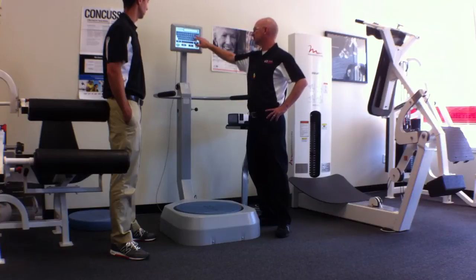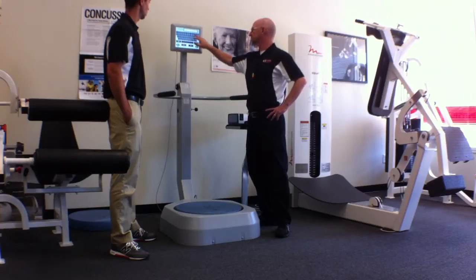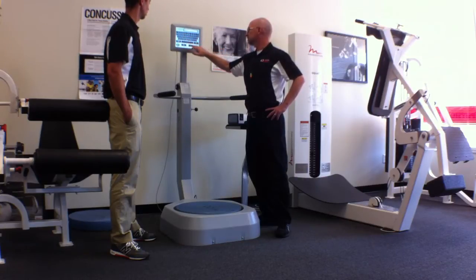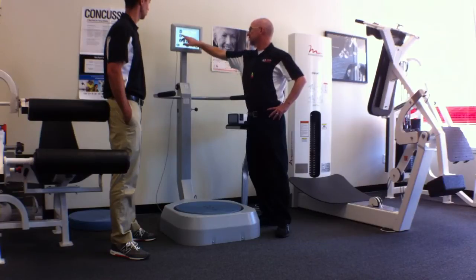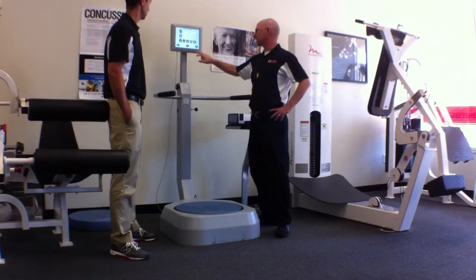Just hit the keyboard, and if you're in a setting, you can either just put their first name or their first and last name. Like if we go to a doctor's office and we want to have that for them, we're going to put Peter B for that. Hit OK. We're going to put his age at 36. We've picked his height in a height range, and then we're going to go to next.